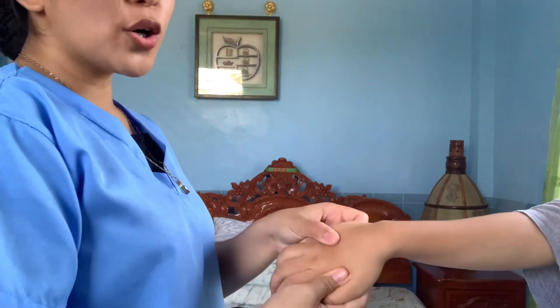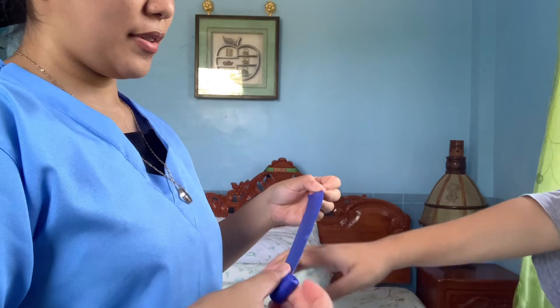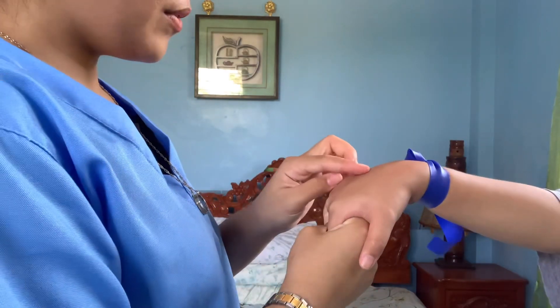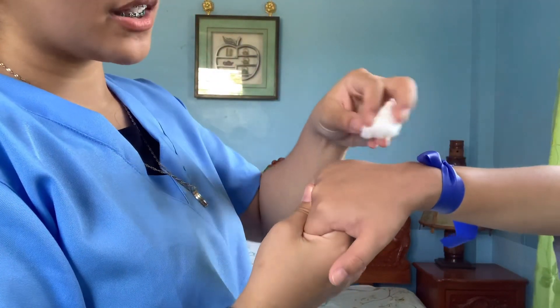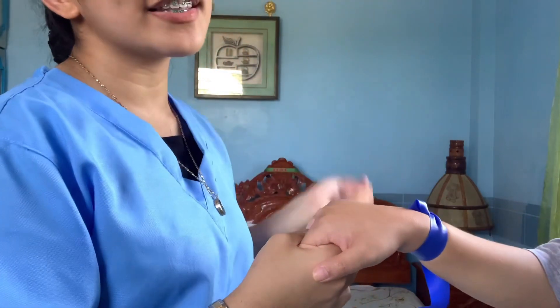Next, we need to determine the IV insertion site, so let us check the veins first. We're going to dilate the vein using the tourniquet. Make sure that it is tight, but not too tight — just enough to make sure that the vein is dilated. She has a nice vein. Next, we're going to clean the IV site using a sterile swab, cleaning from inner to outer. Let it dry down. Do not fan the IV insertion site.